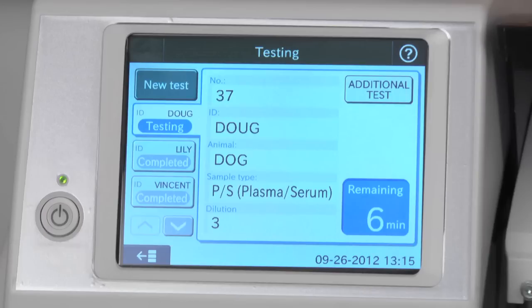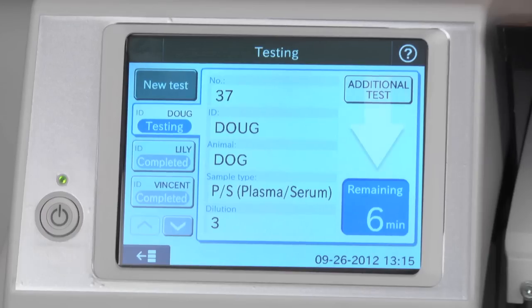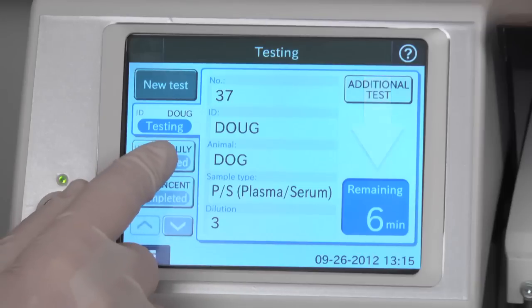The Element DC provides a countdown to displayed results for individual samples as well as an option to see the remaining time to completion for all tests in your queue.